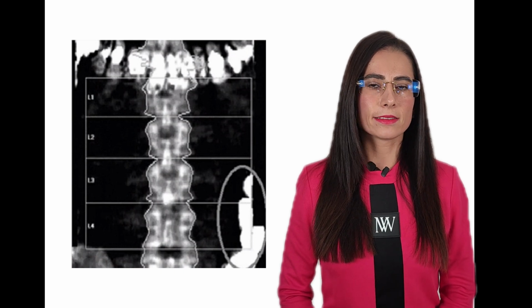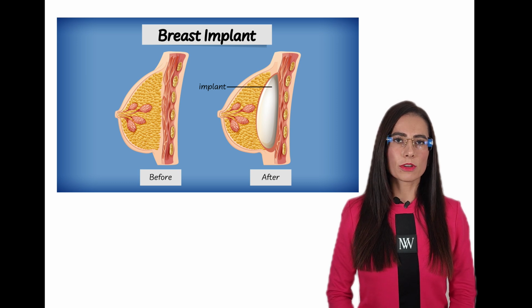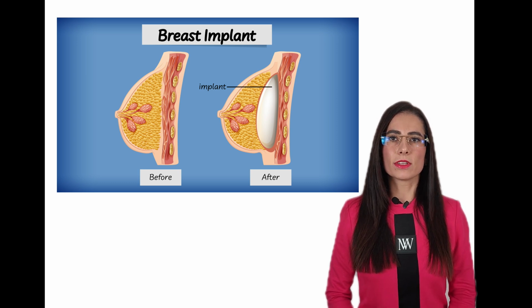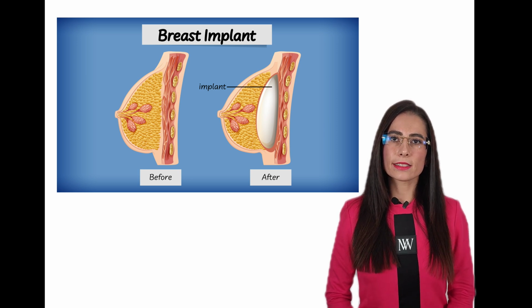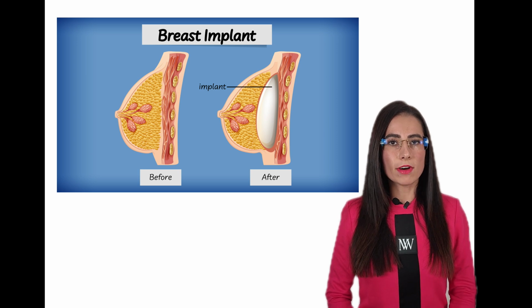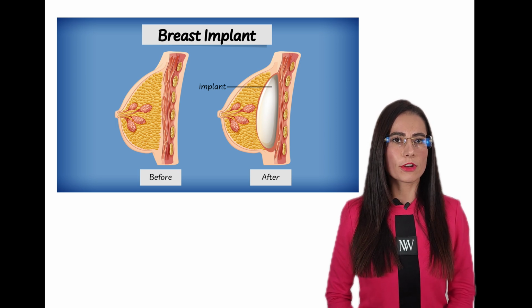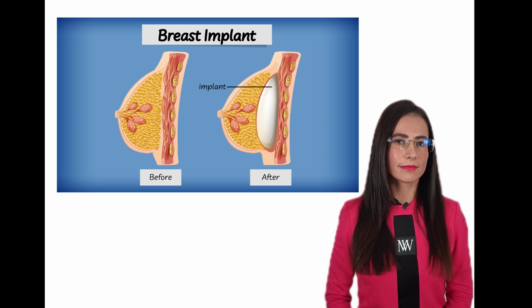You will need to wait 3 weeks for the contrast agent to get cleared before performing a DXA scan. Silicone implants in your chest are another potential threat to the accuracy of the DXA scans, resulting in a higher bone density of your spine than you actually have. In such cases, the total body DXA examination used to evaluate the result of your fitness training by measuring body composition may indicate a lower body fat percentage than the actual one.